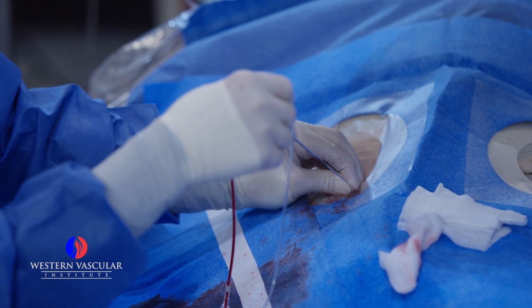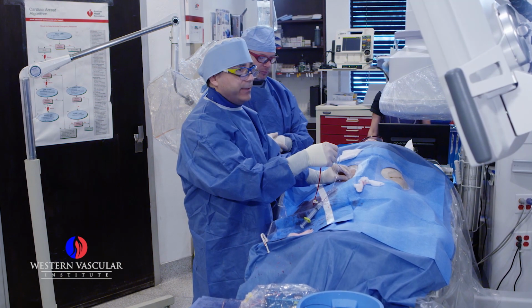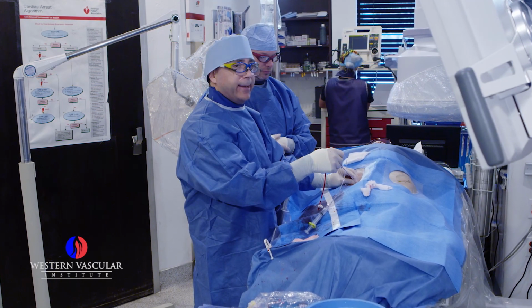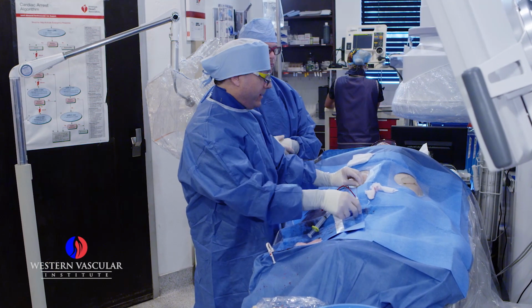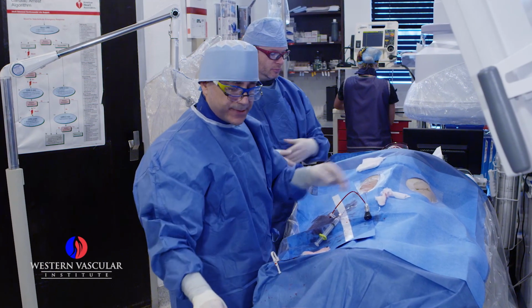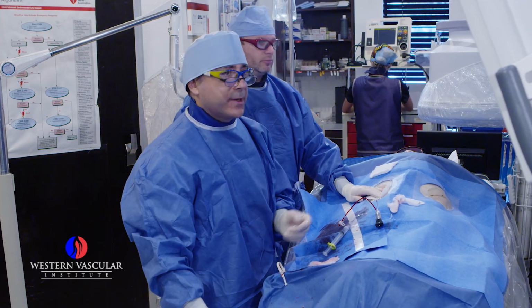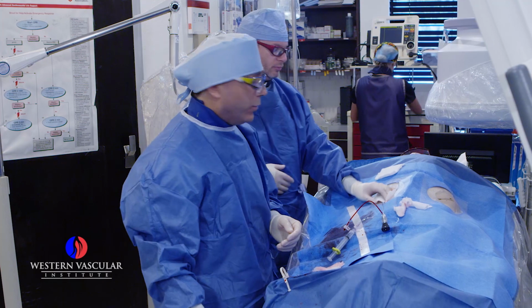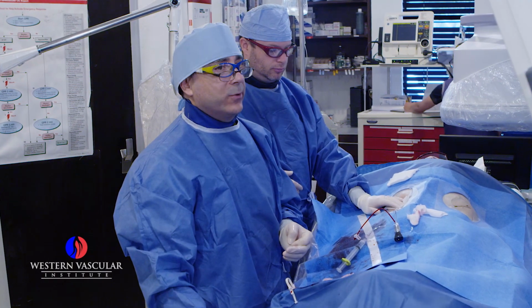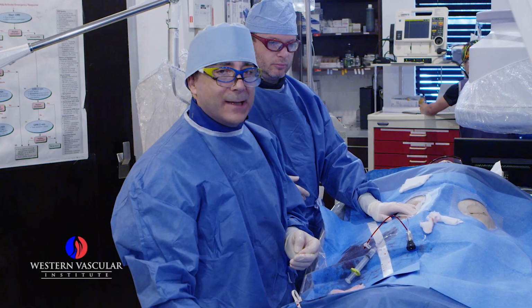Well, I think she'll have a pretty good result with this. We did use the laser to remove plaque right behind the knee. The ultrasound that she had before the procedure showed a blockage behind the knee. The ultrasound we used here in the operating room showed that. The CO2 used showed the blockage there, and also a little bit of dye that we used. So with her kidney function being poor, we used very little dye. We used about 10 cc's total, which really wouldn't hurt anybody. And she should have a good lasting result with this.